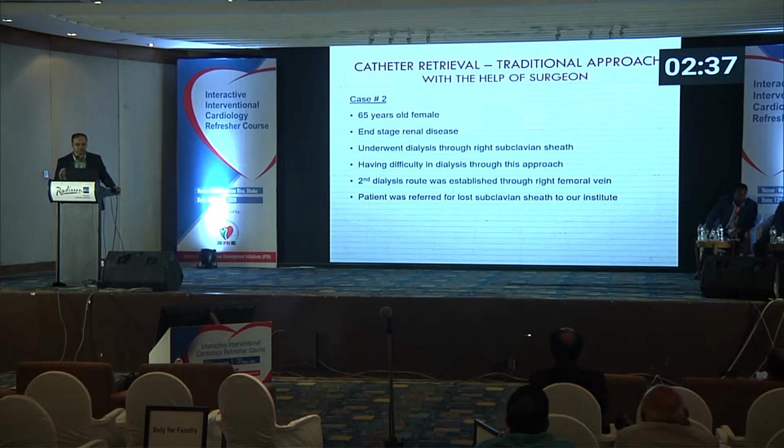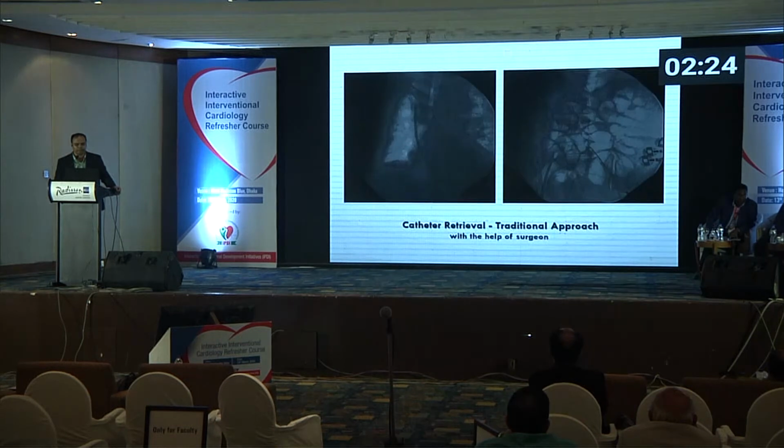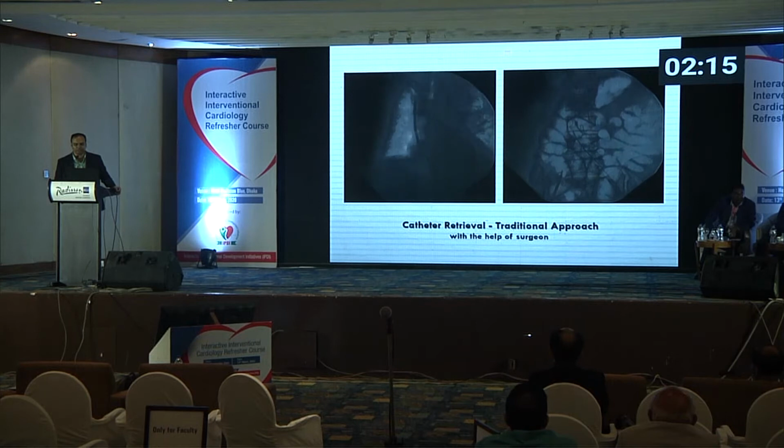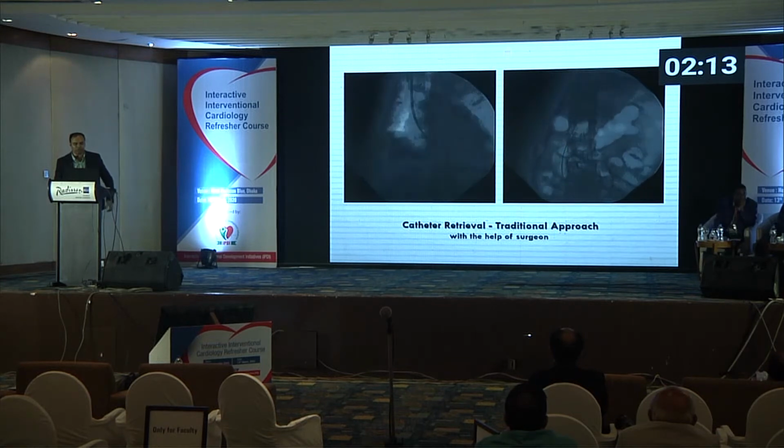And this is case number 2, an ESRD patient having difficulty with the dialysis access site, who was referred to our institute, NICVD. When we took the fluoroscopy, we could see part of the dialysis sheath inside the SVC. So we took a left femoral approach.